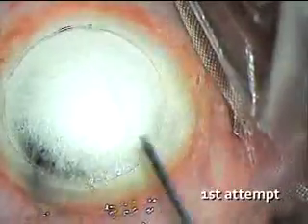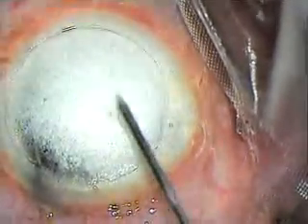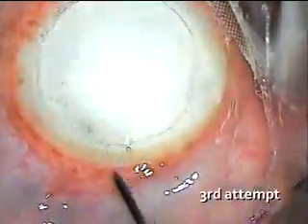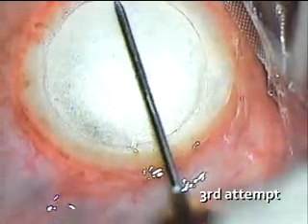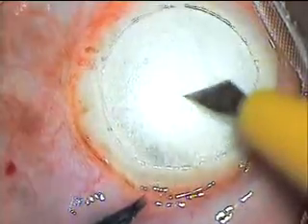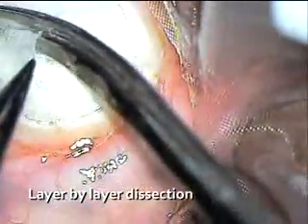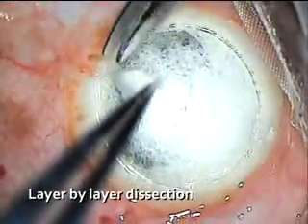Coming to another case, where first attempt failed, second time failed again. The third attempt also went in vain, obscuring the entire cornea. So, deeper incision given and layer by layer dissection of stroma was carried out until the desired depth was reached.